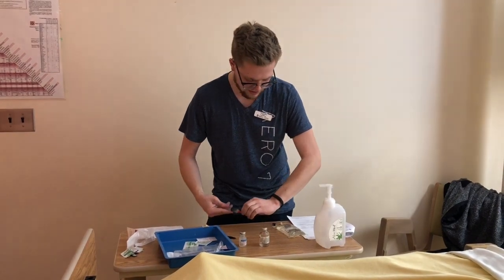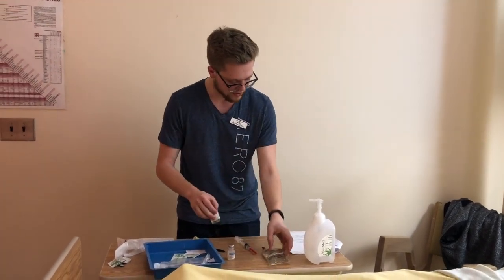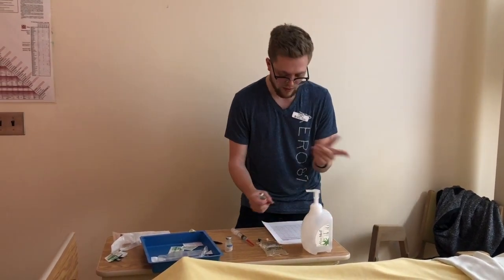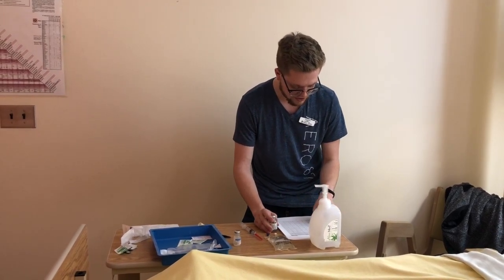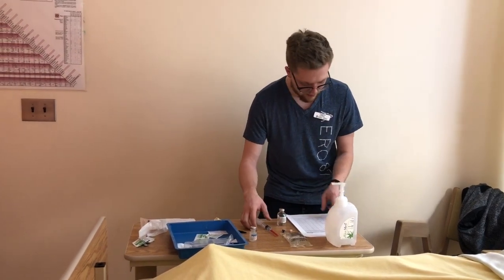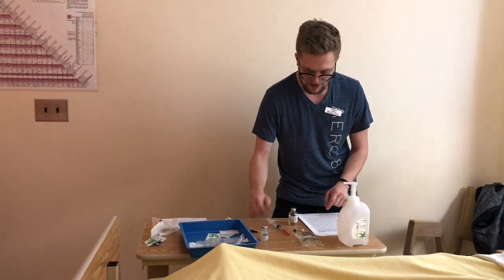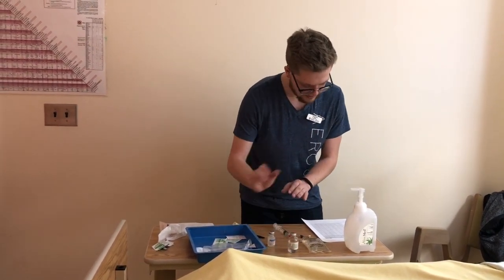So before I insert into my mini bag, we're going to want to make sure that we do our second med check. So we're going to confirm again with what's going on here. So we're going to look at the right drug. We have cloxacillin. We have our right patient, Clark Kent. We know that we're giving 1 gram IV every 6 hours. So we know that the last dose was 6 hours ago. We have our right route, IV. And then we know from the parenteral monograph and the math that I've done that we need to take 1 gram, and that's going to be 4 mLs from the final volume of 8 in here. So second med check is all done.